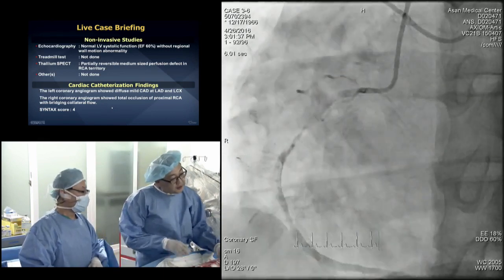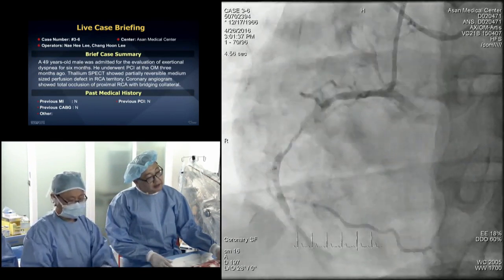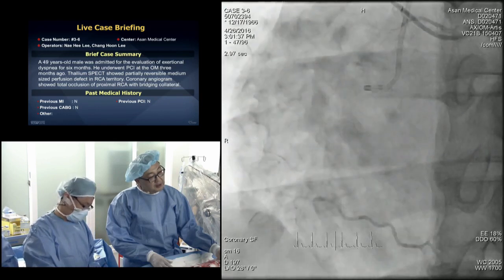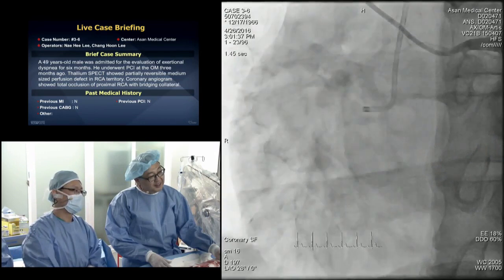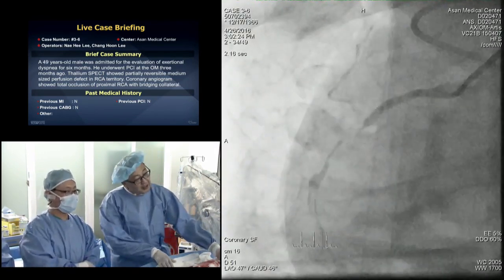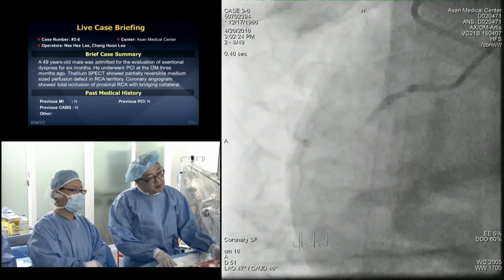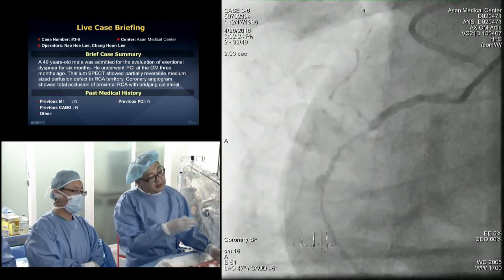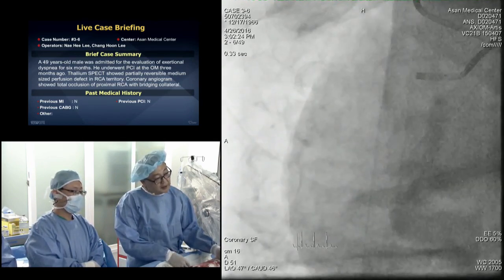Can you see today's angiogram? Yes, this is a bilateral simultaneous angiogram. As you can see, the lesion is very, very simple. Next. This is an LAO caudal view, spider view. In the proximal RCA, the spider view elongates the region, so it is sometimes very helpful.